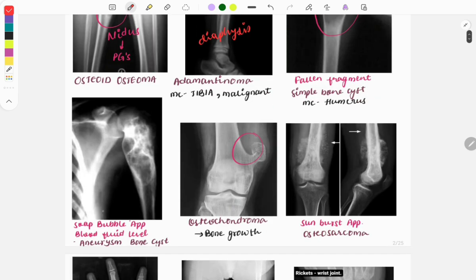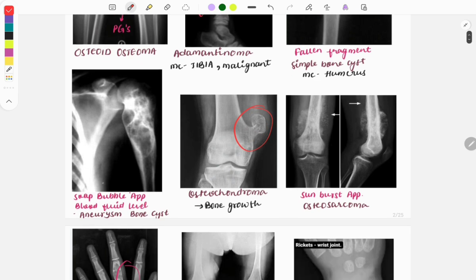The next image is of an aneurysmal bone cyst; you can see multiple fluid levels — blood and fluid levels — because bleeding occurs within this tumor. Another very popular image is osteochondroma, which is extra bone growth and is easy to identify. Moving on to osteosarcoma, you can see the sunburst appearance, and you can easily identify it as osteosarcoma.